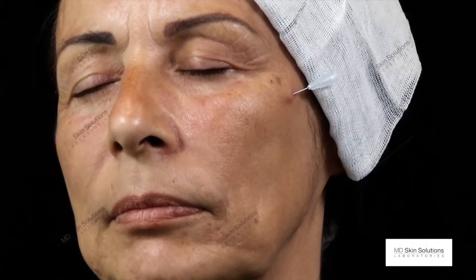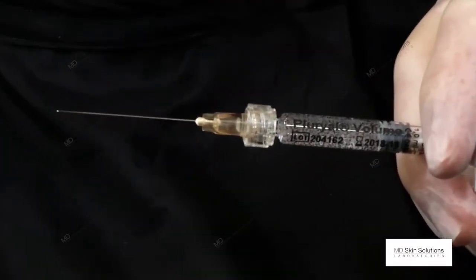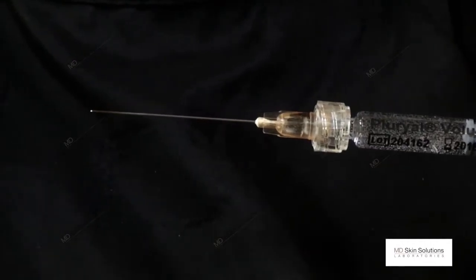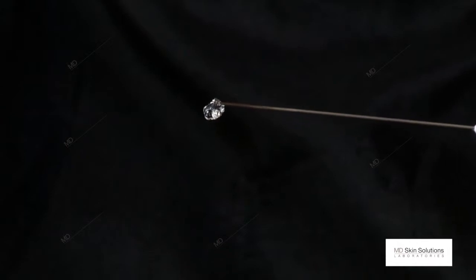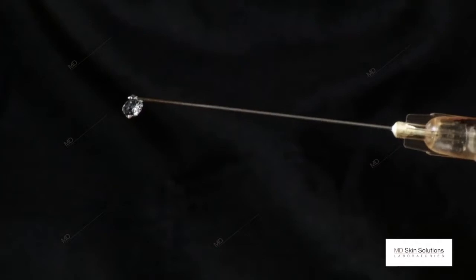The area is the non-sterile area, because we never want to touch any non-sterile area with our cannula. We're using a 25 1.5 inch blunt cannula. Next rule is to prime the cannula, never inject air. And you see how viscous the product is. It's a volumizing hyaluronic acid, Pluryal volume. It stays where I extruded it from the cannula's tip.